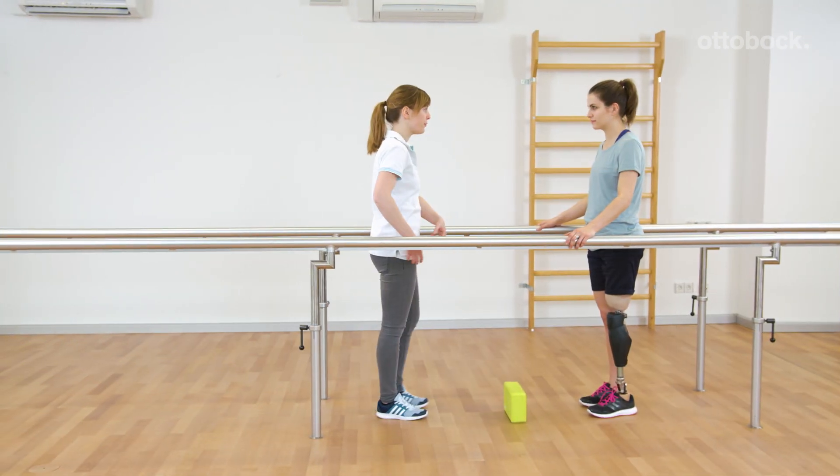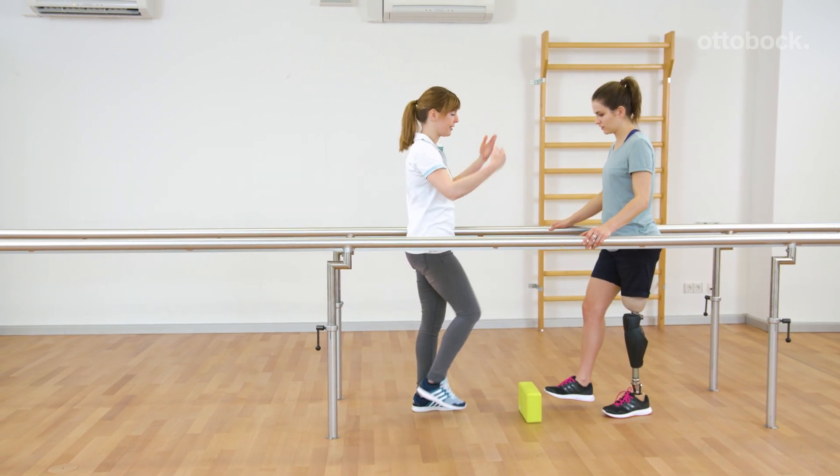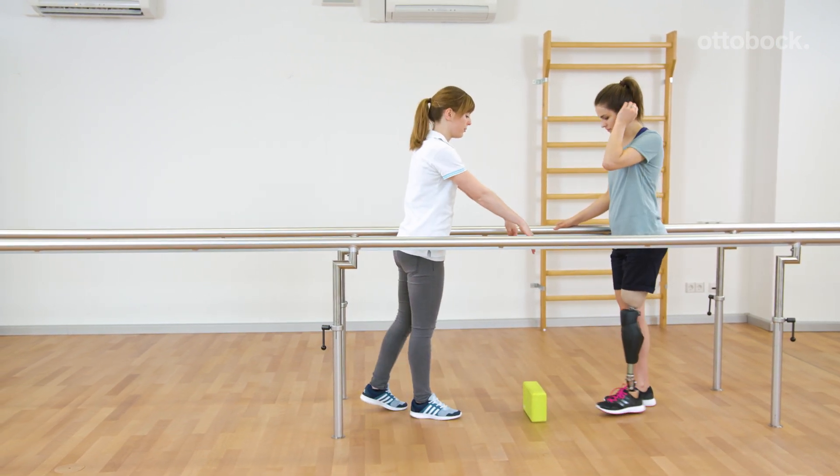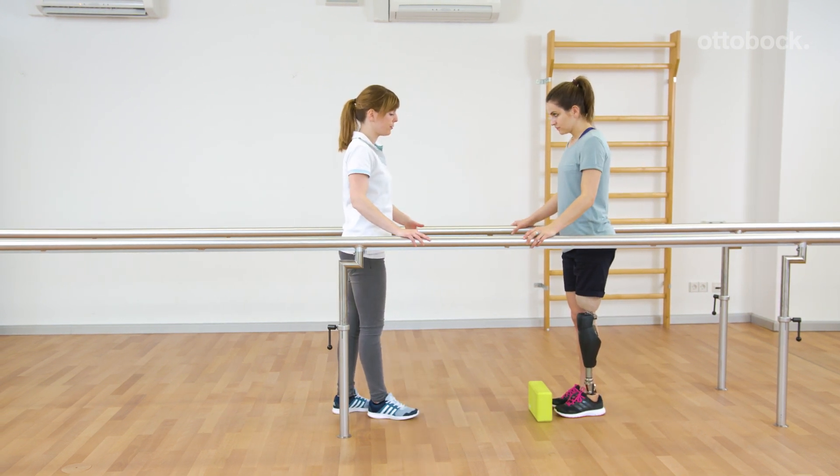Fransiska explains that Rika can use the same motion pattern to step over small obstacles. First the pattern is trained in the standing position and later out of walking. The obstacle function equates to the stairs function.